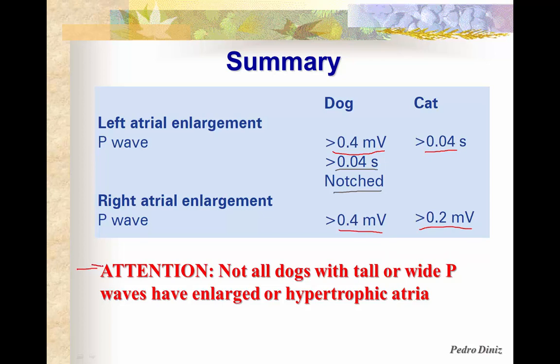Remember that these are not written in stone, so always confirm initial findings in terms of morphology of waves with other imaging, especially echocardiogram, where you can get precise measurements of the heart.